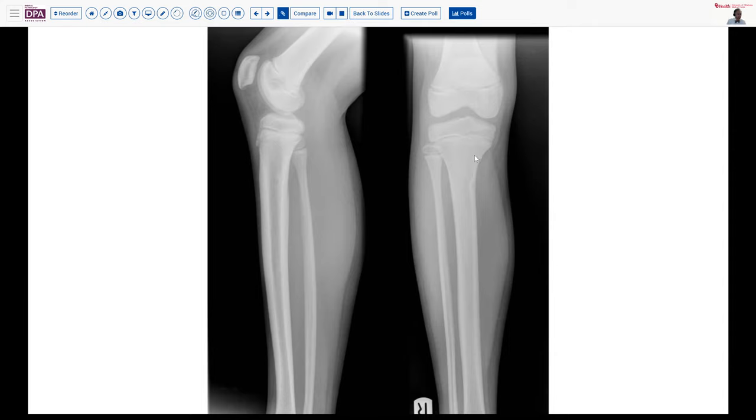So radiographically here, we can see there's relatively little abnormality. He's got open epiphyses, both in the tibia and the femur, also in the fibula. And looking around, we can see really there's just this one little abnormality here, a slight thickening of the cortex here in the metadiaphyseal juncture with a little bit of central lucency.